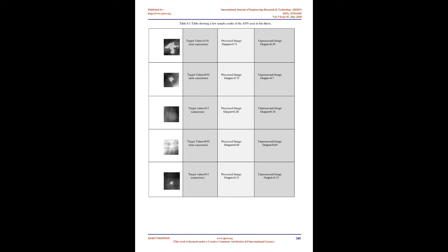In this filtering process, we take any pixel and its neighbor pixels, determine their median, and assign this median value to that pixel. We calculate the median by first sorting all the pixels' values from the neighborhood into numerical order and then replace the pixel being considered with the middle pixel value. When the number of pixels for calculating the median is even, then the average of the 2 middle pixel values is the median value. The median has 2 main advantages.